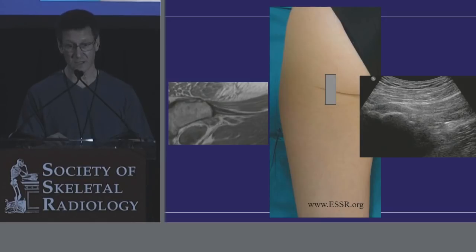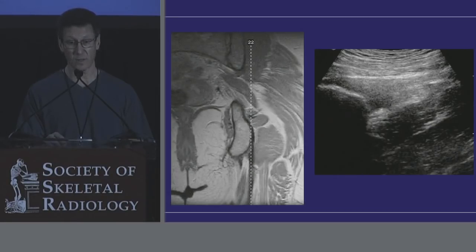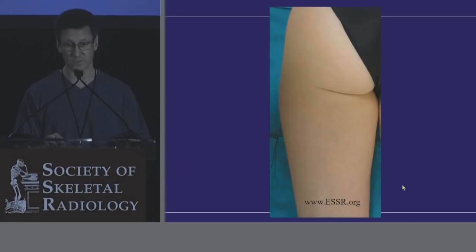Ischial tuberosity, hamstring, hamstrings. Now, if you slide a little bit more medial on the tuberosity, you're going to get into the conjoined tendon portion of the hamstrings. If you slide out a little bit more lateral, you're going to get more into the semimembranosus portion. And remember, these are not just lines, they're really bands of tissue. So you really do have to sweep back and forth through them to see the entire dimension of this structure.